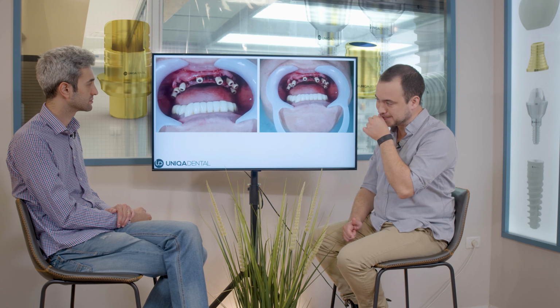She got used to those relations, she had those bridges for a long time, she wants to stay with them. I need to extract the teeth, and I want to change the bridges to new bridges in the same relations. So this way it's much simpler for me as a doctor to do one bridge at a time and not everything from the start. It's also possible to take relations and do everything in one time. This time we decided to take one bridge at a time.